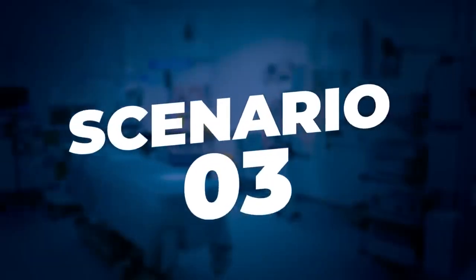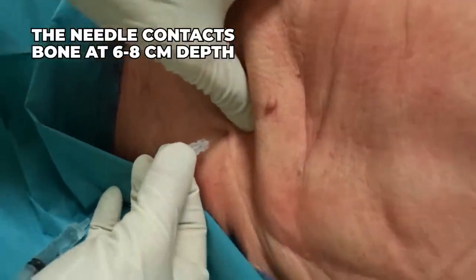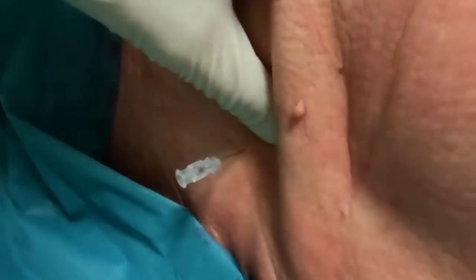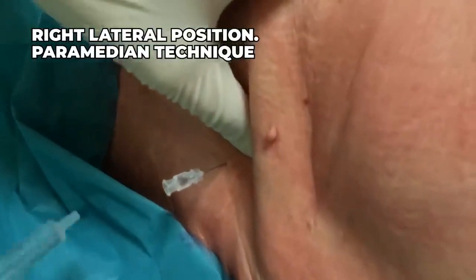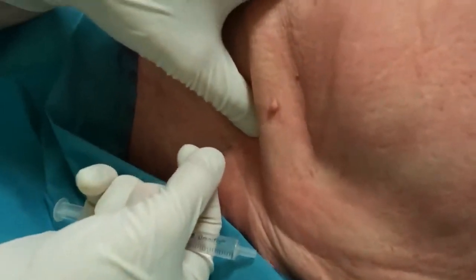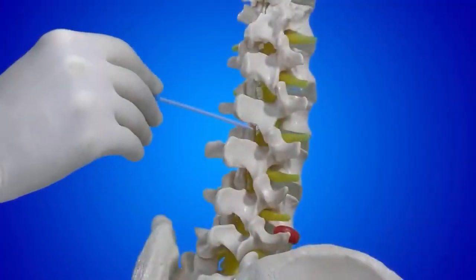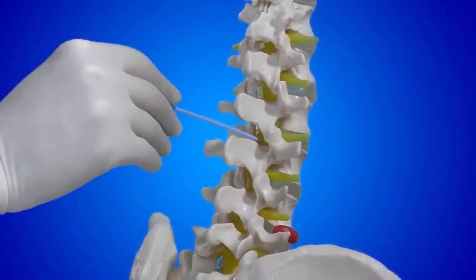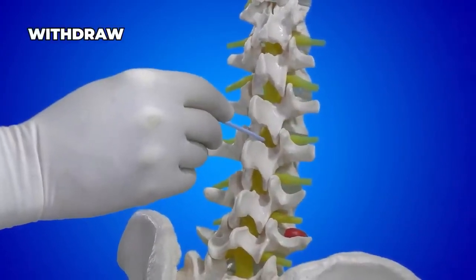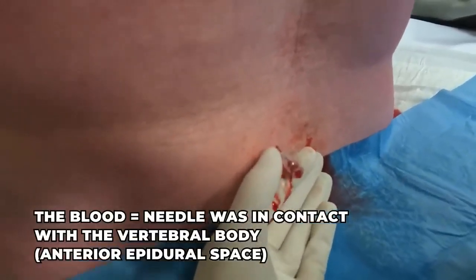Scenario number 3 is where the needle enters up to 6 to 8 centimeters and touches bone. Most of these situations, in my clinical observations, the practitioners are now desperate and they tend to abandon the procedure and take the needle out. But in fact, if you touch the bone at 6 to 8 centimeters distance, what that really means is that you have missed the dural click. You were in a correct position, but you missed the dural click and you passed through the subarachnoidal space. What you need to do is pull the needle back by 1 centimeter and watch for the CSF to show up at the hub of the needle.